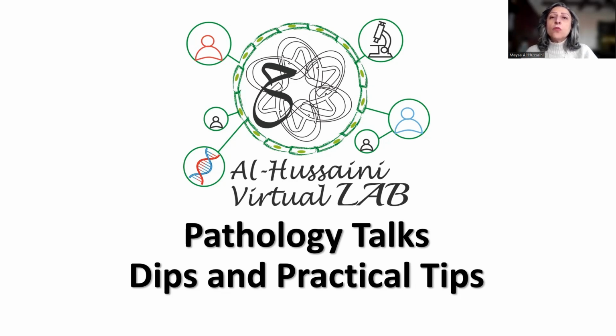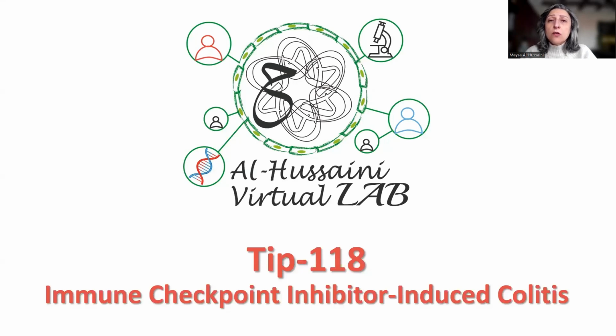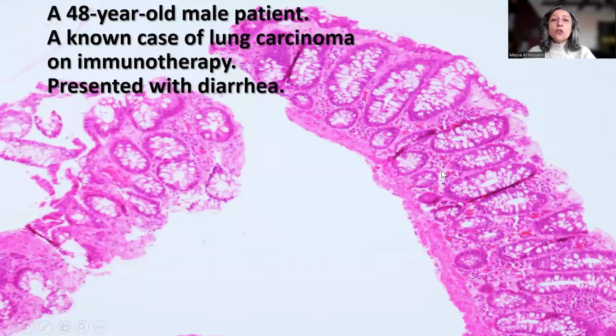What I'm going to be sharing with you today is a nice example of a newly recognized entity, which is immune checkpoint inhibitor-induced colitis. So this is a case of a 48-year-old male patient who's known to have lung carcinoma, for which he was receiving immunotherapy, and he presented with diarrhea. This is the single most common presentation of colonic manifestations related to immunotherapy, diarrhea.